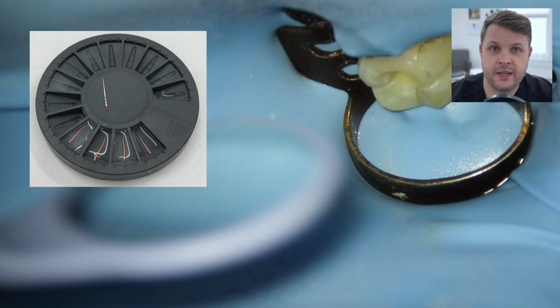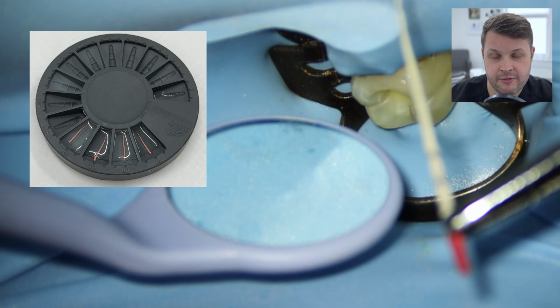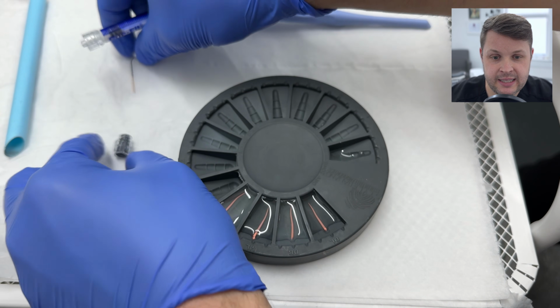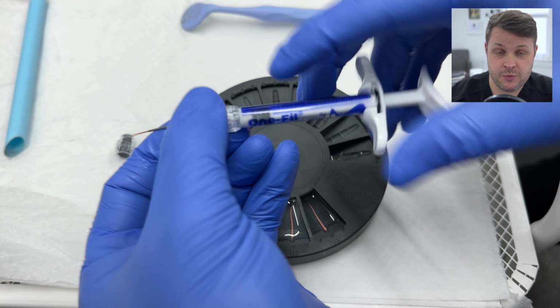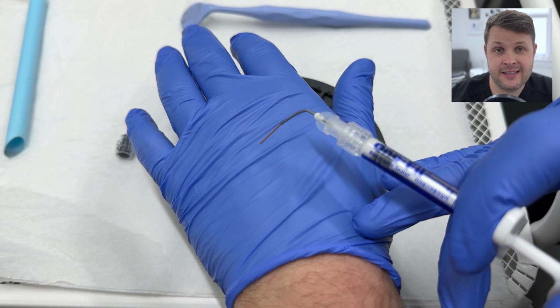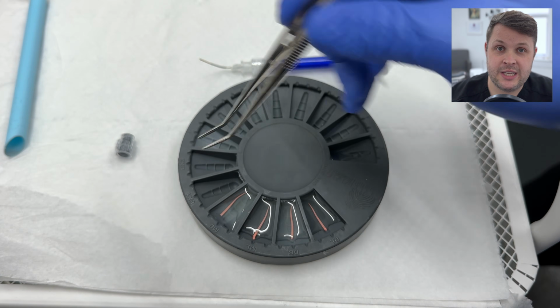And once we've used all our paper points and all the canals are dry, ready for our obturation, I'm going to use one fill here. This is a bioceramic sealer, and I'm going to use these visco tips. Before I do any obturation with any canal, I get everything set up. I'm going to make sure my visco tip is loaded with bioceramic sealer.